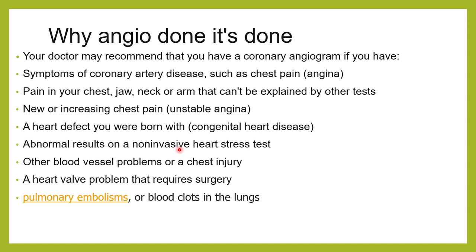Suppose the doctors are suspecting any congenital heart disease, they can order an angiogram. Suppose the doctor has ordered a stress TMT, or an echo, and therein the doctor has felt that there are some abnormal results which could be because of a blockage, that time also we confirm it only by doing an angiogram.